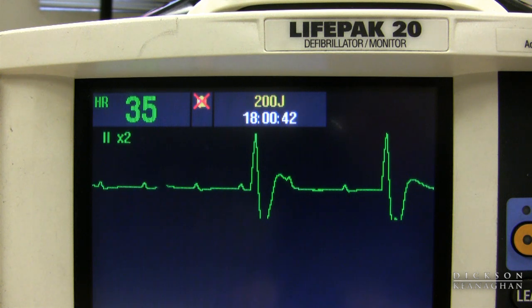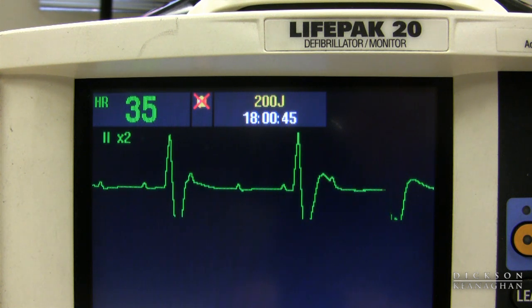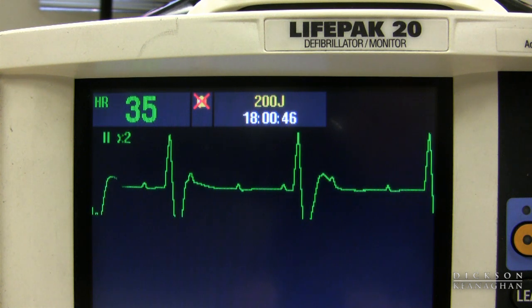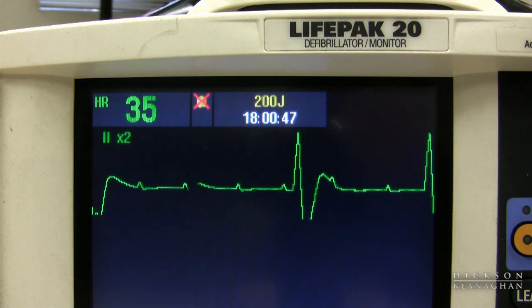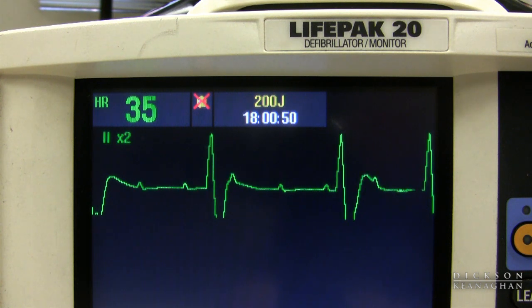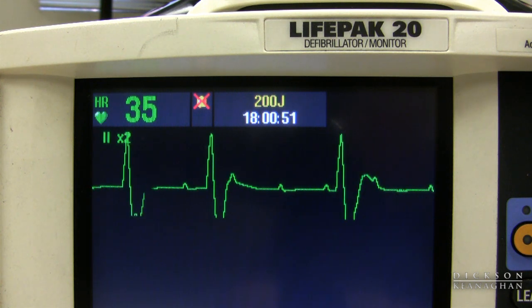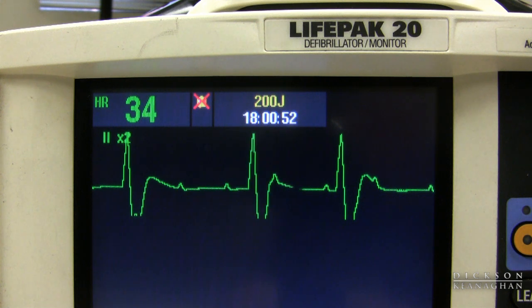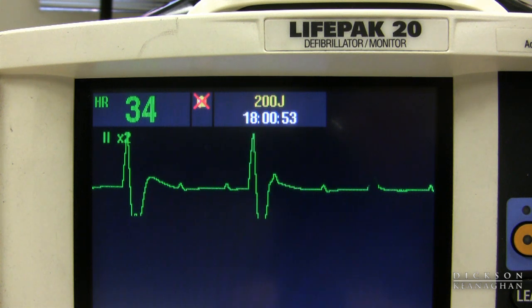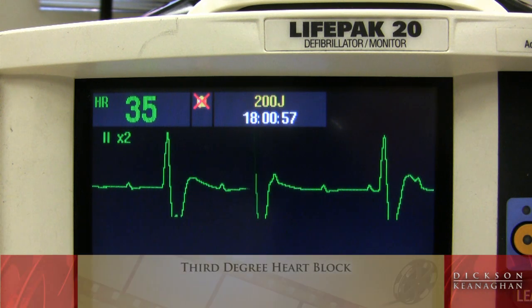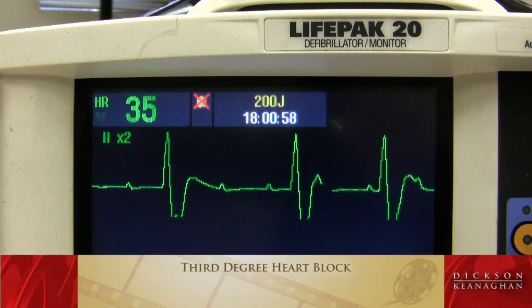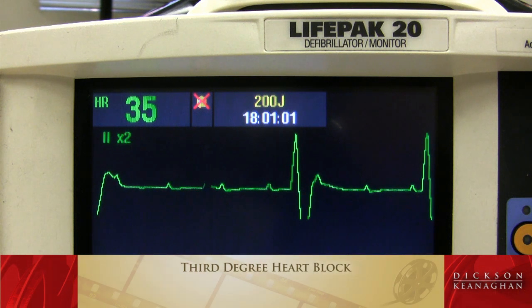In this rhythm, I notice wide QRSs. The heart rate is also slow, below 60. I see more P's than QRSs — I know it's a heart block — and there is no consistent relationship between the P's and the QRSs. So this is a third-degree heart block, complete heart block, also called AV dissociation.